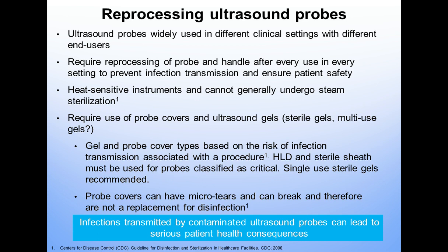So just a few words about reprocessing of ultrasound probes, just to kind of bring it all together. Ultrasound probes are widely used in different clinical settings, as I've just mentioned, with different end users. And they require reprocessing of probes and the handles after every use in every setting. Nobody's excused from providing proper, safe patient care to our clients and to yourself, to protect yourself. This will prevent infection transmission and ensure patient safety.